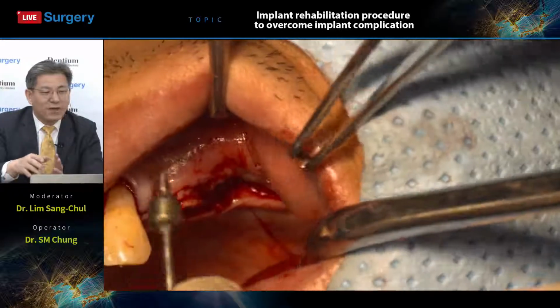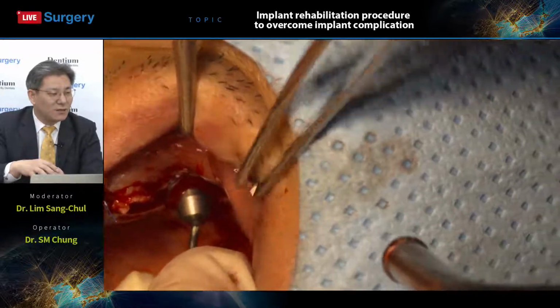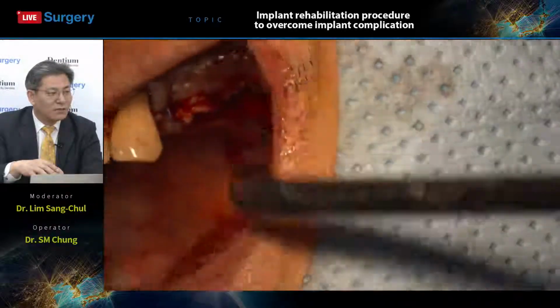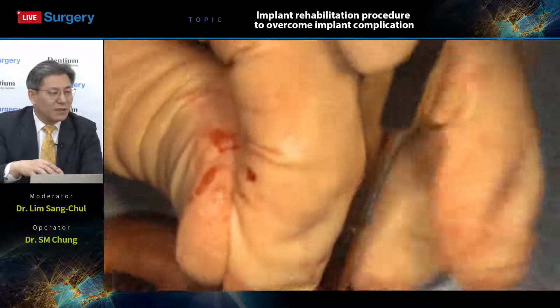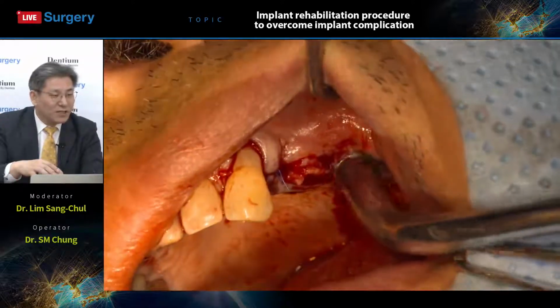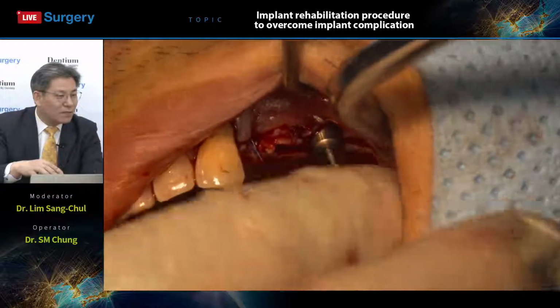During this procedure, maybe some arteries are scratched, so a little bit of bleeding. Okay, a little bit more. The bleeding due to... but fortunately now all the bleeding is stopped.